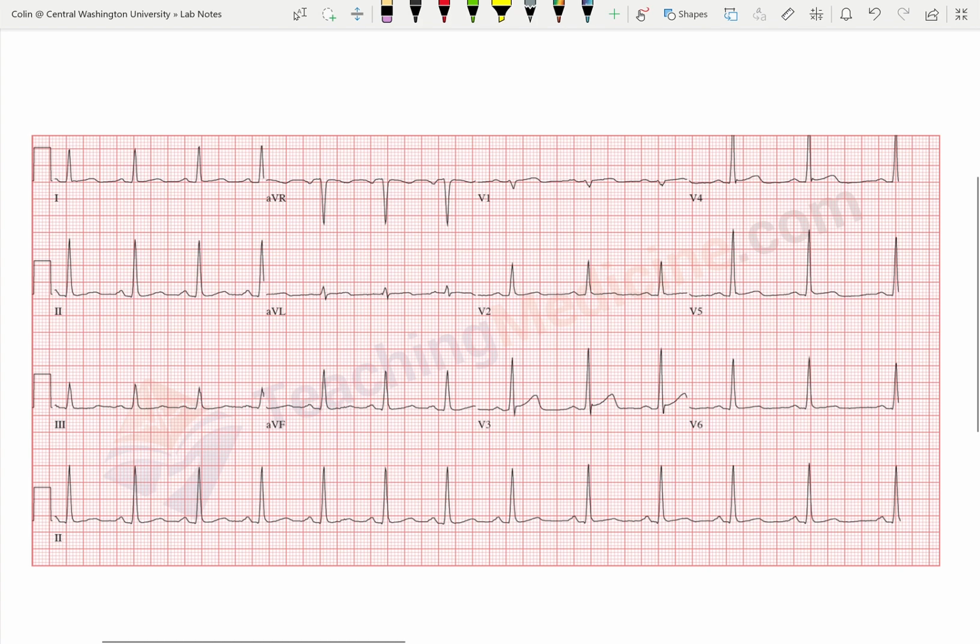So pretty simple. Imagine we're all standing around a car, right, in a big circle. Some of us are going to see the rear bumper and the trunk, and others of us are going to be standing in front of the hood and the windshield, and we're going to see different parts of the car. And if someone threw a rock at the car and hit the front bumper, the people standing in the front of the car are going to see the damage to that front bumper, but the people on the back of the car are just going to see a totally normal looking car, right?